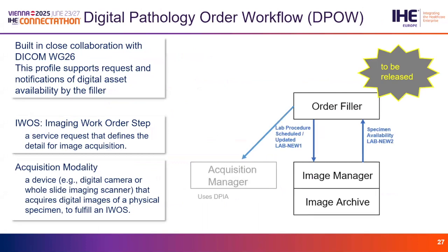Communication of additional data elements will be possible, and more complex use cases potentially have been theorized for future, but that's where, again, we need your help. For example, if we want to highlight a region of interest on a slide, request that some type of stain be performed with that particular region of interest analyzed, which is exactly what happens when a user picks a region of interest for HER2/neu IHC analysis on invasive tumor in a breast cancer.